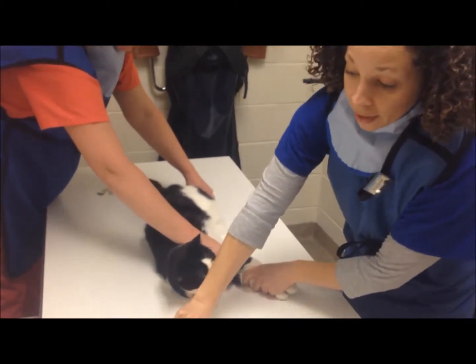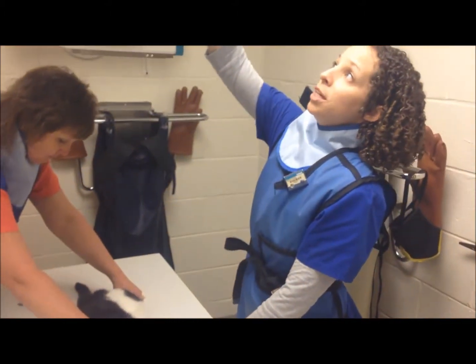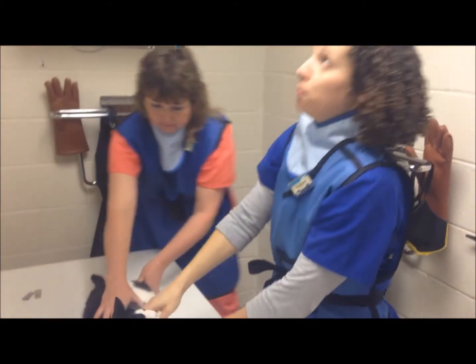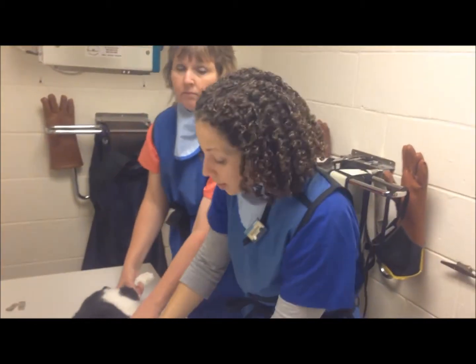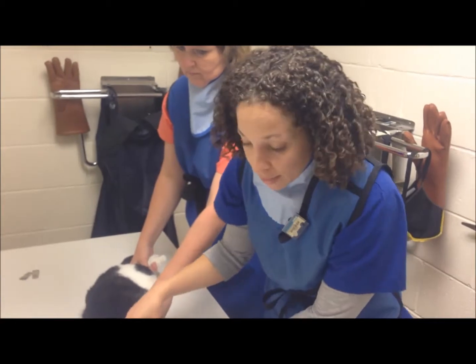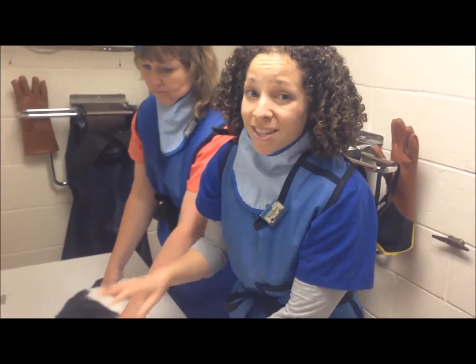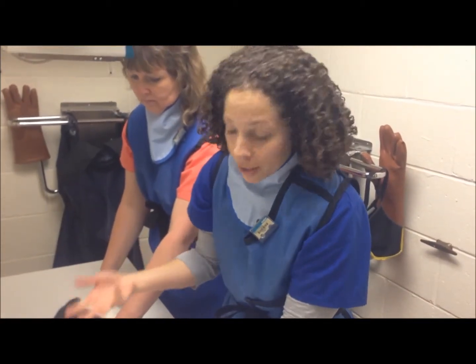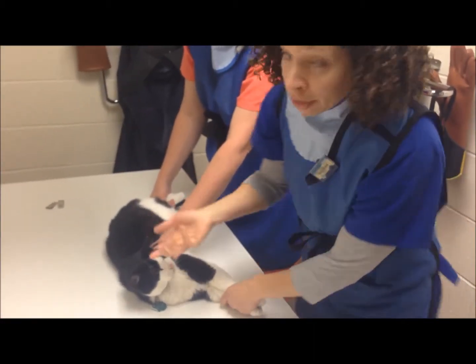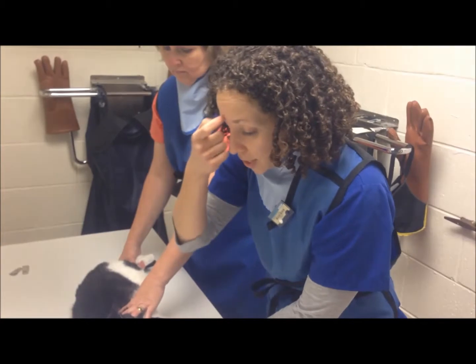So based on that, we're going to go ahead and set the machine for 65 kVp and 5 mAs. That's what we'll use to get our abdominal views, and then we're actually going to bump up our kVp by 6 to 8 for the actual contrast study. So if our survey radiographs aren't diagnostic enough, we'll go ahead and proceed with the study.